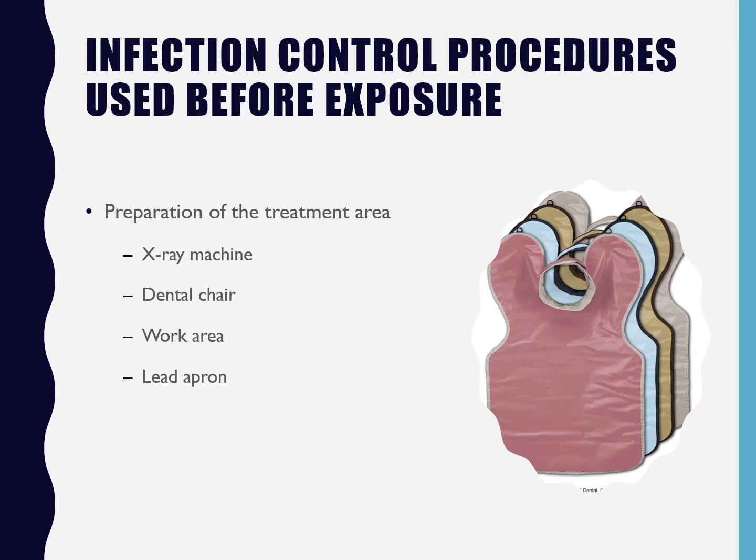We would turn it on. And then we're going to prepare our dental chair. We're going to place barriers on our chair. We're going to prepare our work area, so we're going to have our computer on. We're going to have barriers on our computer. We're going to have the patient's chart brought up on there, and we're going to be clicking on the patient's chart. We'll find the patient we want, and then we will open up the x-ray stuff in that.